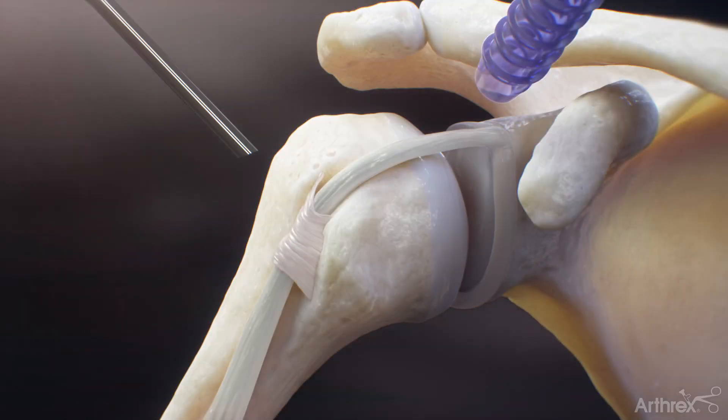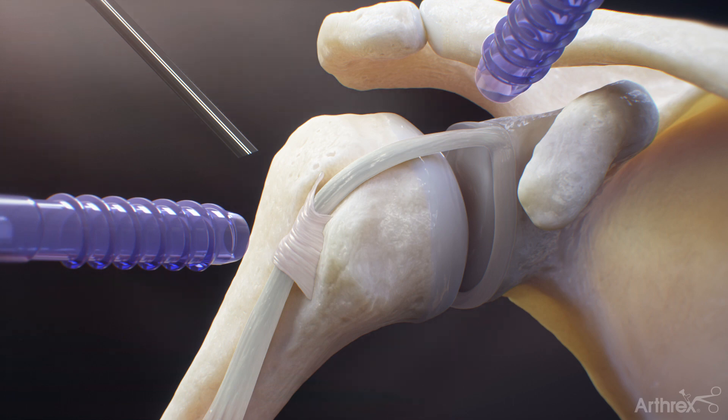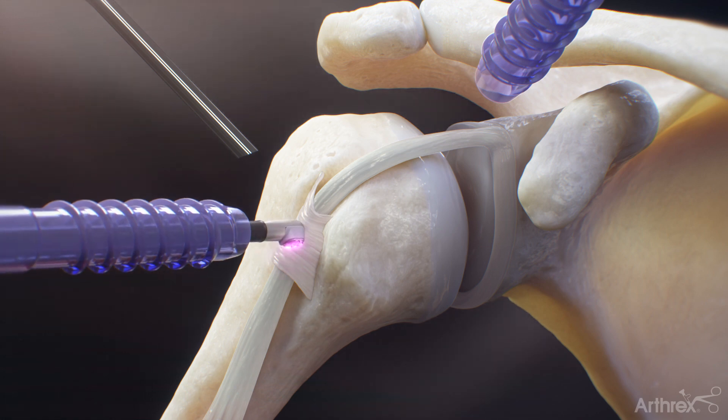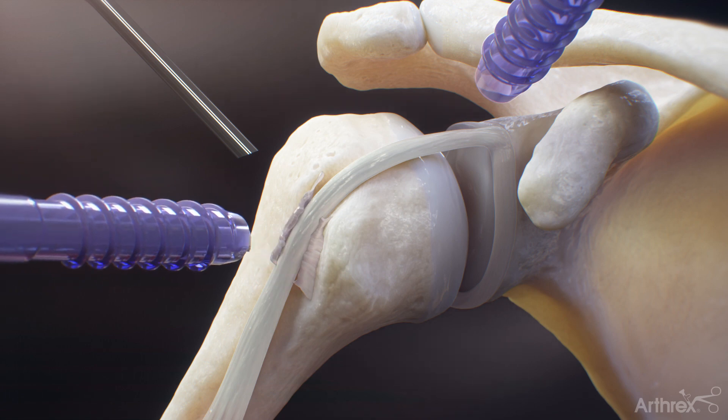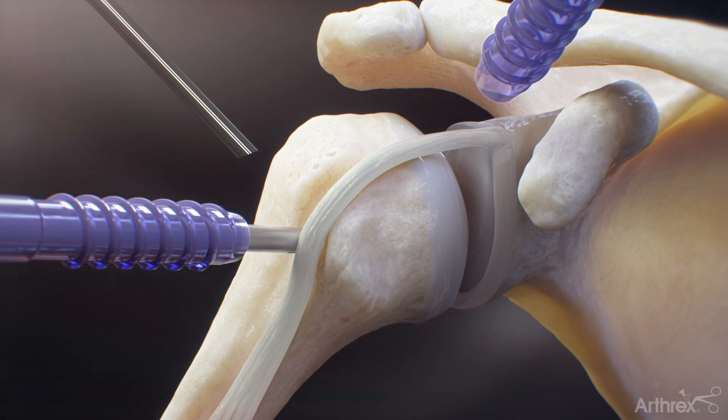In the subacromial space, insert a cannula in line with the intended anchor insertion site. Place the drill guide on the bony surface of the proximal humerus at the desired tenodesis location. Drill a pilot hole using the 3.0 mm drill until the positive stop on the drill guide is reached.